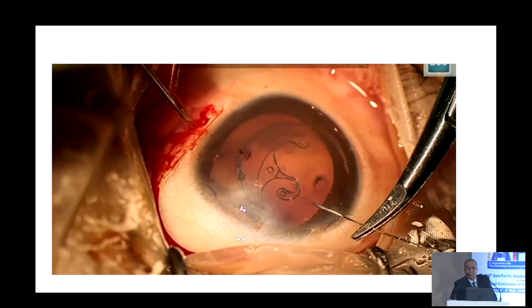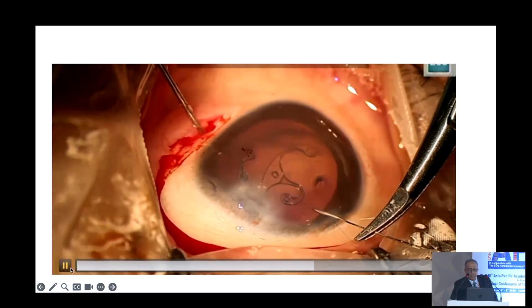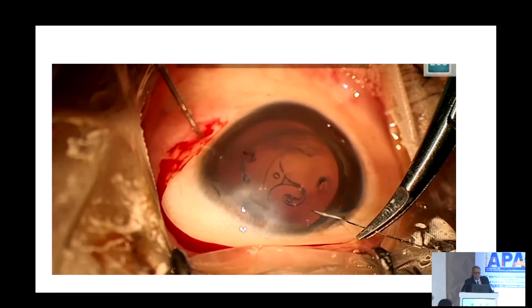I couldn't control it, and I just hit the posterior capsule. The other thing I was going to say is that if you have a problem trying to get your needle in, especially if you have a small paracentesis, then I just put my viscoelastic cannula and follow along, because the viscoelastic cannula will open up your incision. So you just follow your needle along your viscoelastic cannula and then you'll get into the AC without catching the corneal lamella. Okay, great.